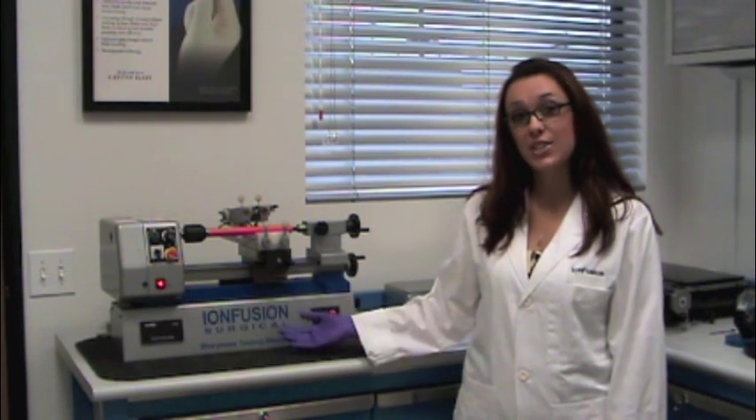Hello, welcome to the Ion Fusion Testing Laboratory. Today, I'm going to demonstrate our sharpness testing machine. Here's how it works.